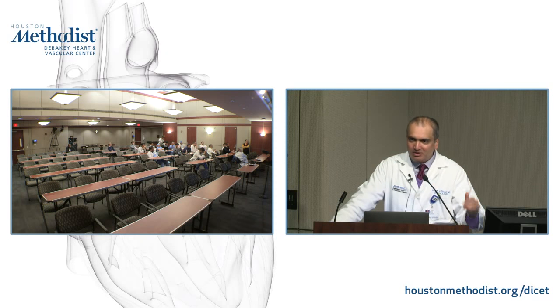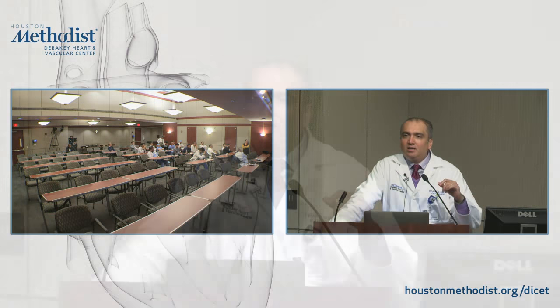In that particular study, they did look at water imaging as well, and they found that there was some increase in water content in these individuals without the presence of any late gadolinium enhancement. The challenge is that with edema imaging techniques, when you have a significant wall motion abnormality, you get slow flow, and that slow flow leads to high signal as well. So it can be a mimicker.